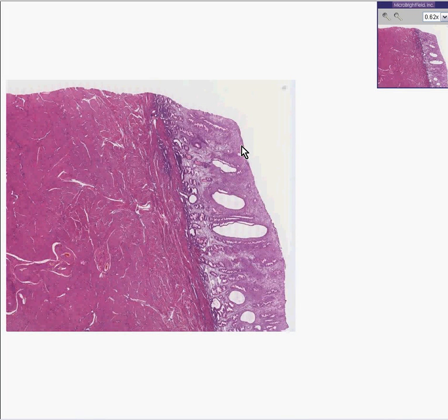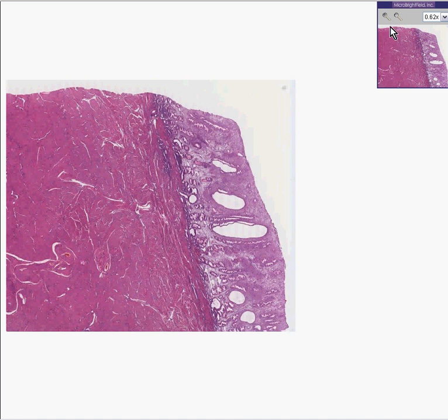Now that we have learned how to differentiate proliferative from secretory phase, here is the quiz. First of all, you know this is an endometrium because you see a lot of smooth muscle here, and you can see a lot of glands over here, and everything in between the glands is stroma. You can notice that some of the glands are in the superficial myometrium, which is normal.